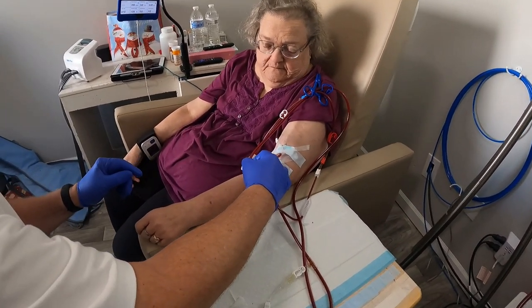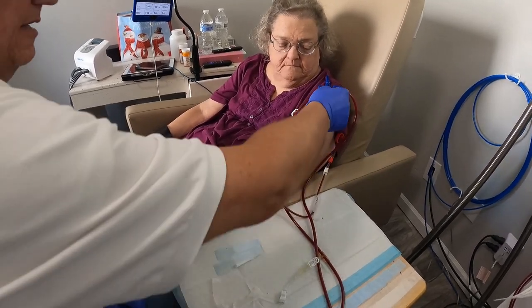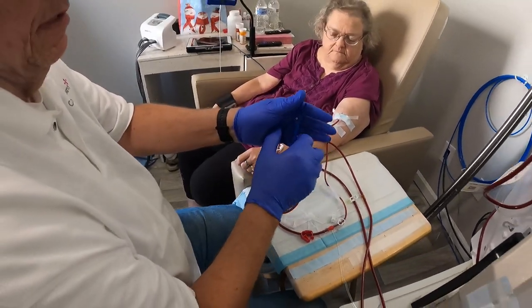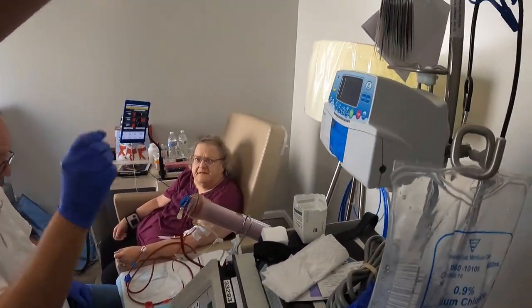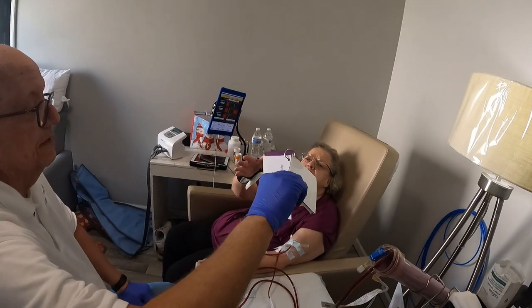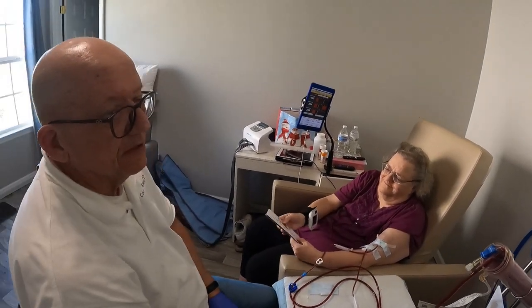We need to do this part. We pull off the emergency pads, and then pull this clip off. Lay these lines out here. I hang these clips up there. And then we need the cards. We use these cards at the end. Trisha can tell you what they say, but we always read them anyway.